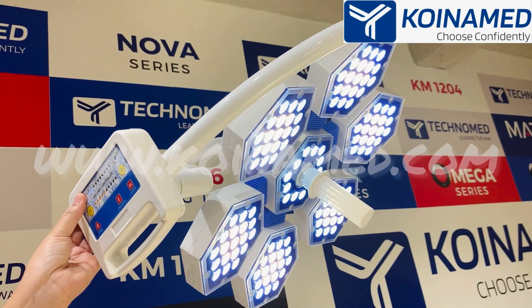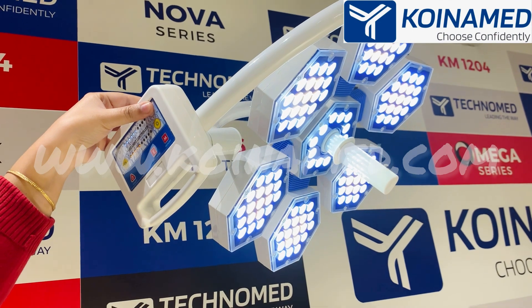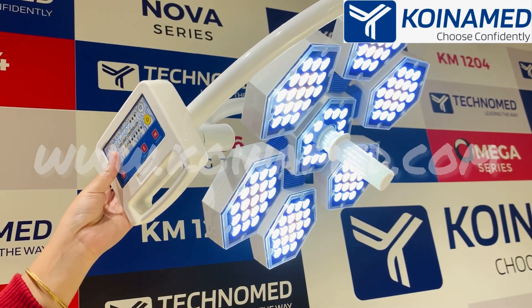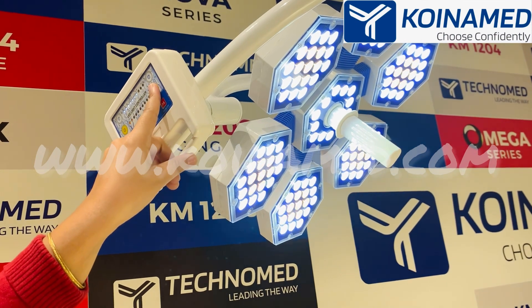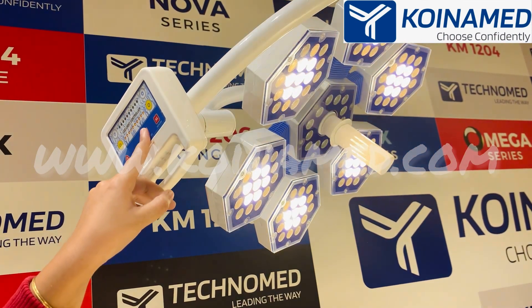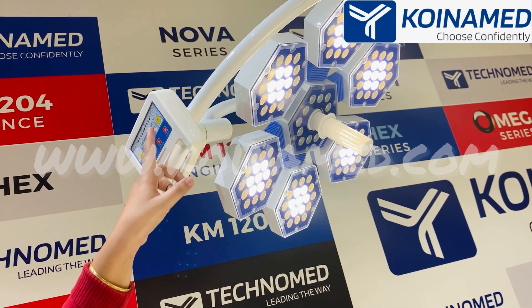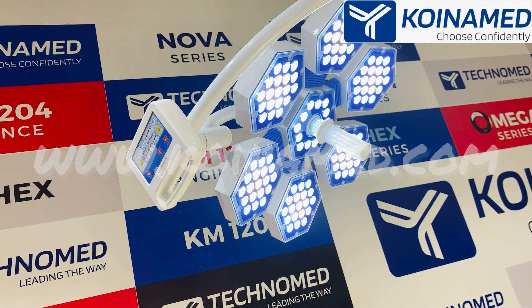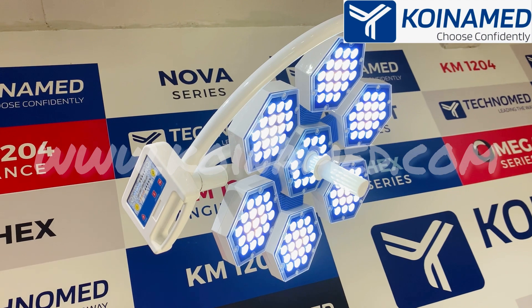From here you can decrease the white light and from here you can increase the white one. The same goes for the yellow — from here you can decrease the yellow and from here you can increase it. When you touch the endo mode, only yellow light will be lit up. With the memory function, it will provide 50% white light and 50% yellow light.